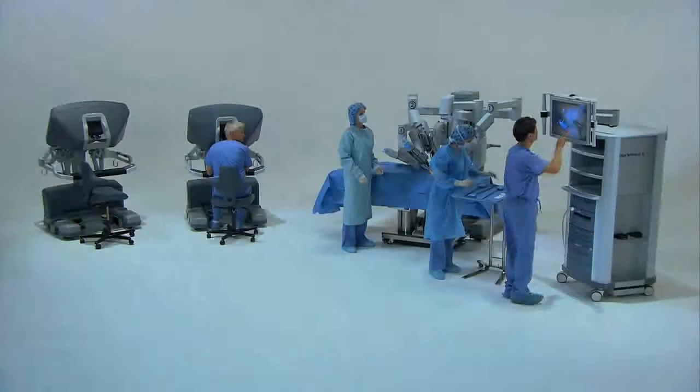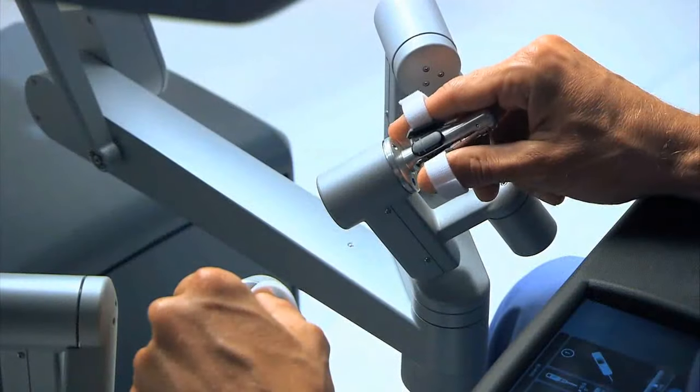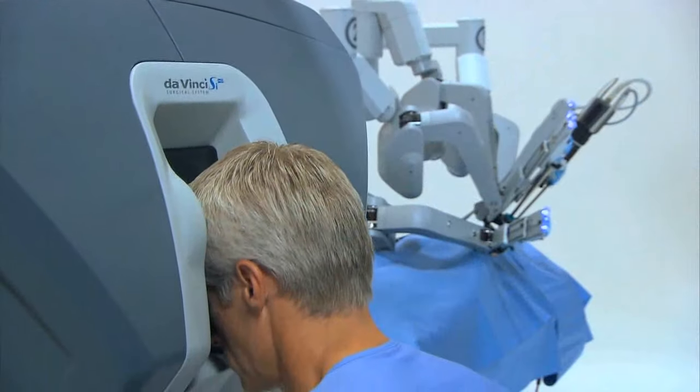When people hear about robotic surgery, they have visions of an autonomous device doing the operation upon them. In actuality, the robotic da Vinci system utilizes a console at which a surgeon sits and controls all the movements of the arms attached to the patient. A computer system translates the surgeon's movements into movements of the robot arms.